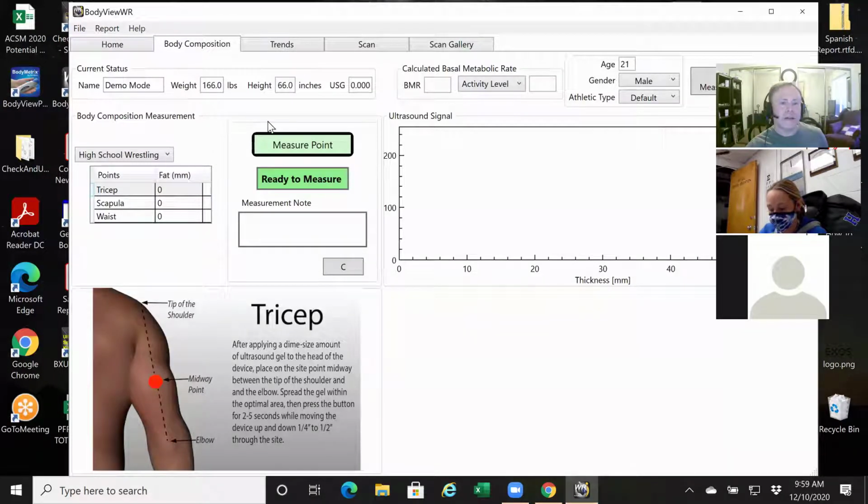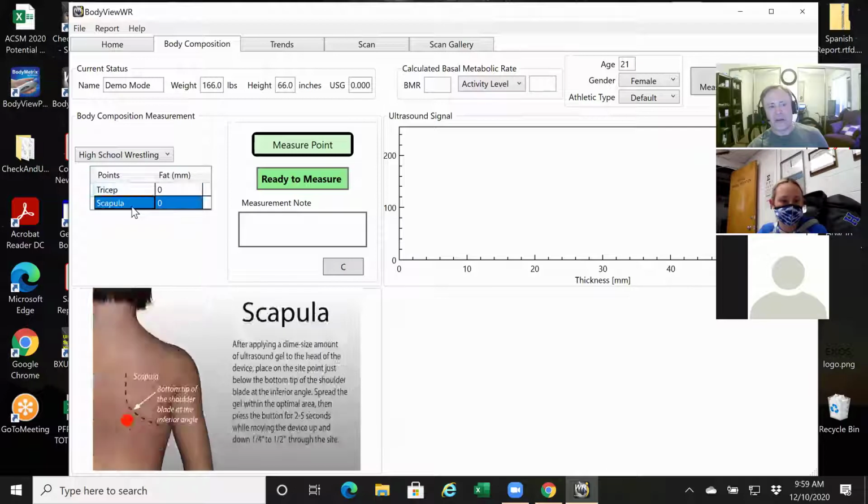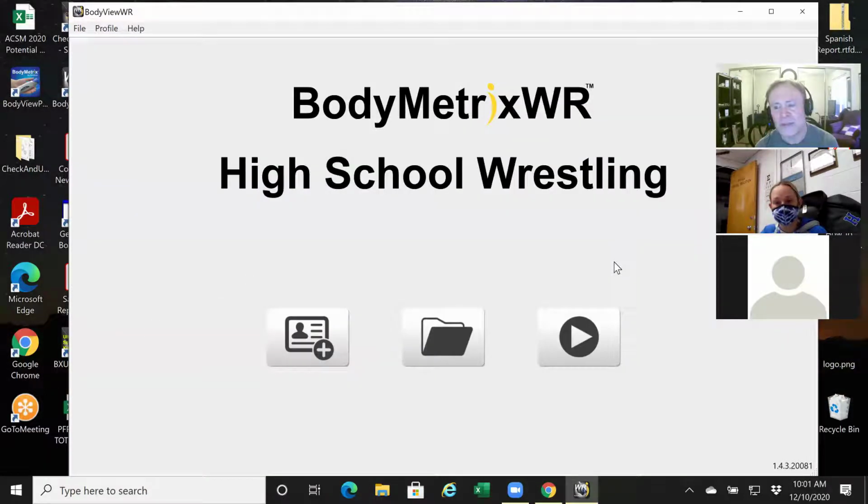The only thing I didn't discuss is females. Are you going to have female wrestlers? I honestly am not sure if we have any. Okay. So the only difference with females, the technique, everything is the same, but we're only measuring 2 sites. Okay. I'm sure you probably already knew that. Yeah. Okay. Pretty simple. I think just practicing with it a little bit and using good technique, that analysis of the graphs that we talked about, you should be good.